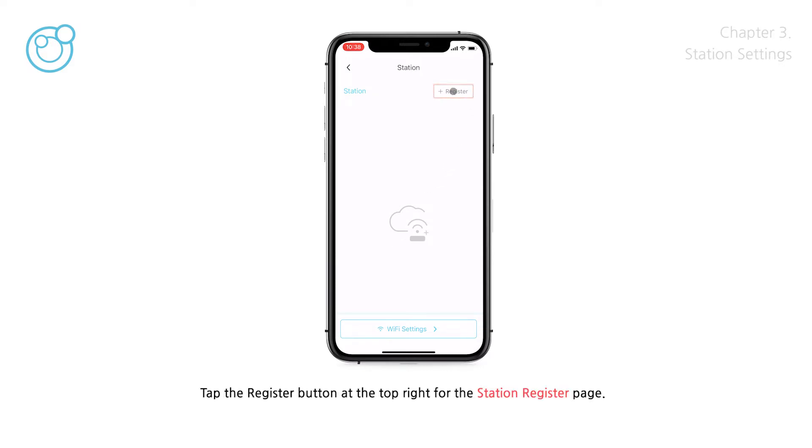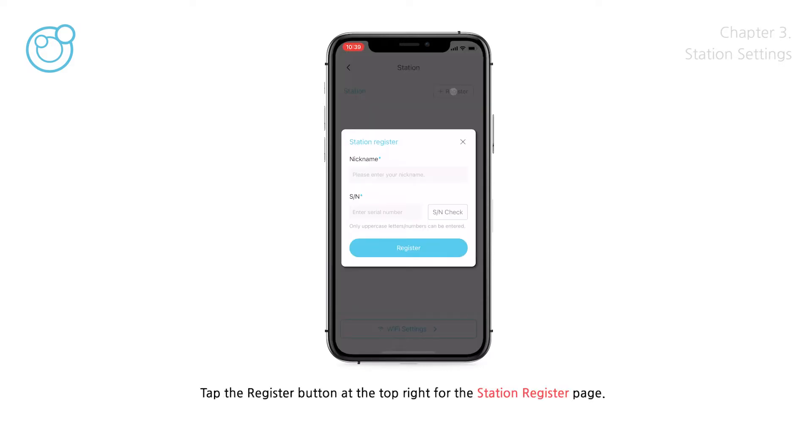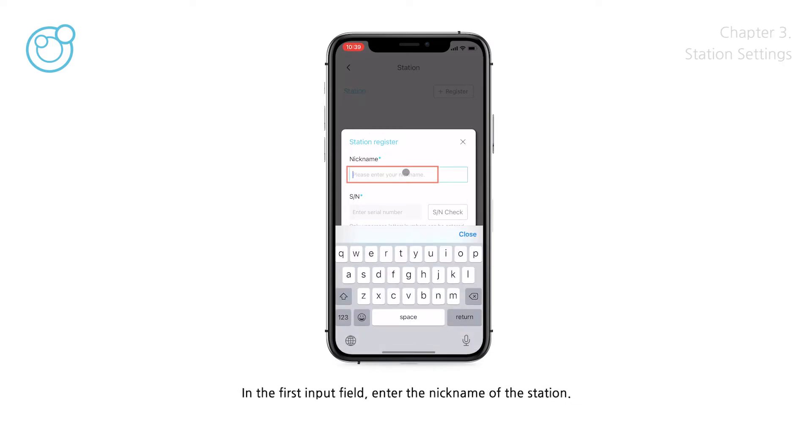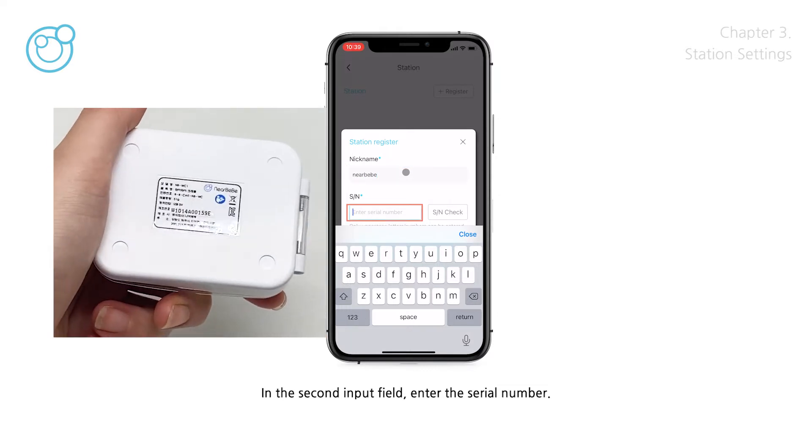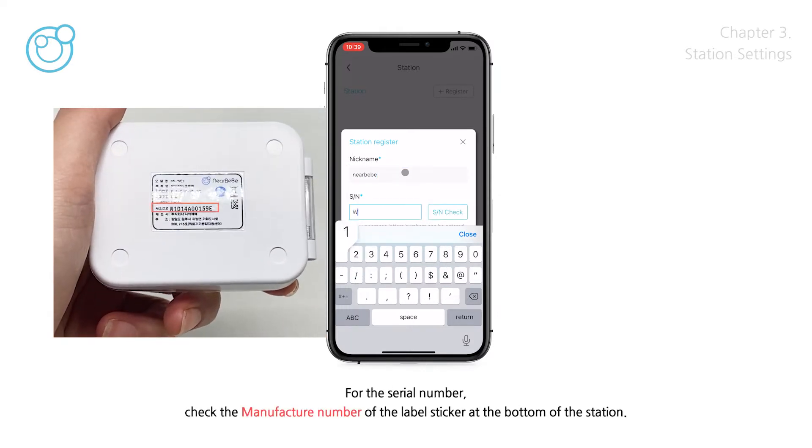Tap the Register button at the top right for the Station Register page. In the first input field, enter the nickname of the station. In the second input field, enter the Serial Number. For the Serial Number, check the Manufacture Number on the label sticker at the bottom of the station.